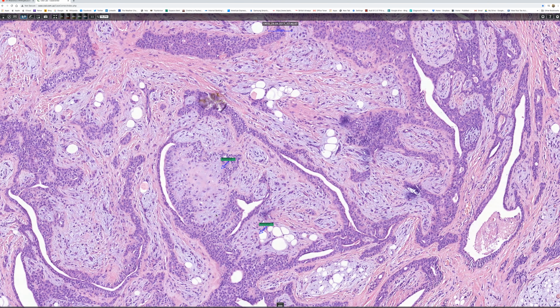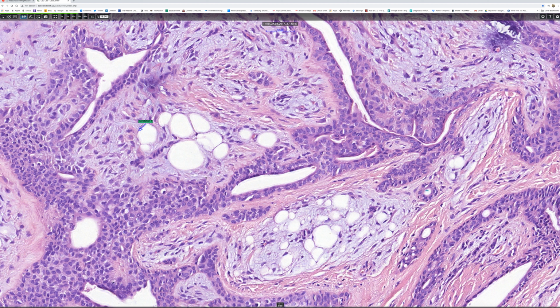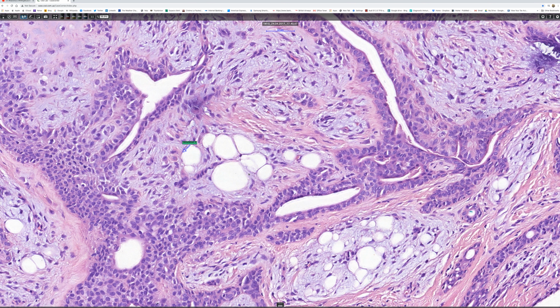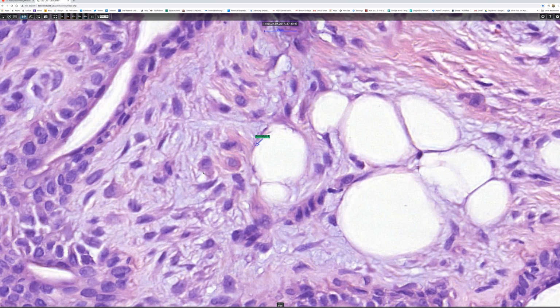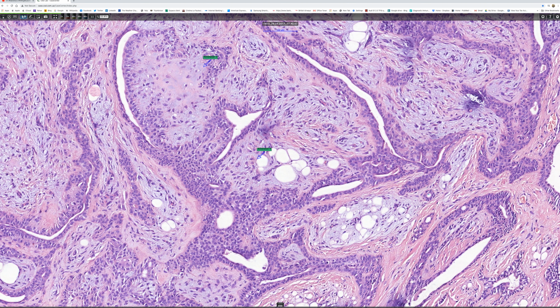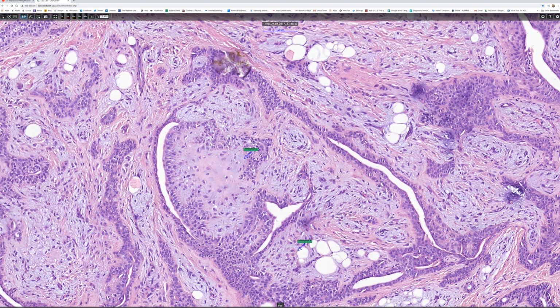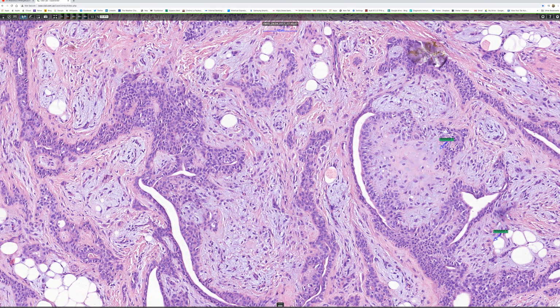Sometimes chondroid differentiation is very marked, and you can see calcification in mixed tumor, and sometimes you can see bone formation. Now the stromal cells are variably spindled, or they're plasmacytoid, as you see in this field, where they have abundant eosinophilic cytoplasm and the nucleus is shoved towards the periphery. And in some cases, the stromal cells are vacuolated, so you can have clear cells.